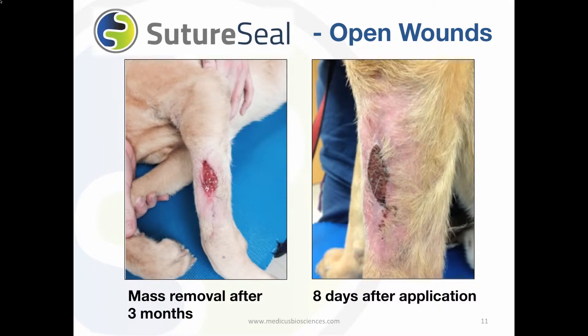Let's look at another open wound on the front leg of this Labrador retriever. SutureSeal was applied to the open wound that did not heal following a mass excision for 3 months. Eight days later you can see the healing progress. Even though he continued to lick and chew at the wound, SutureSeal was able to keep the wound clean and dry.